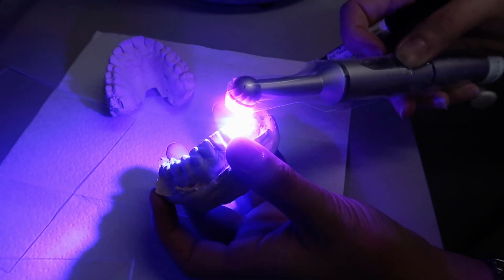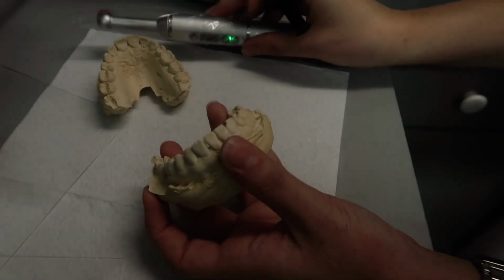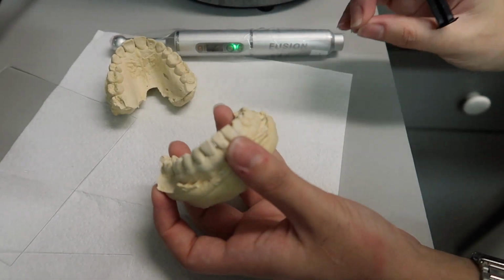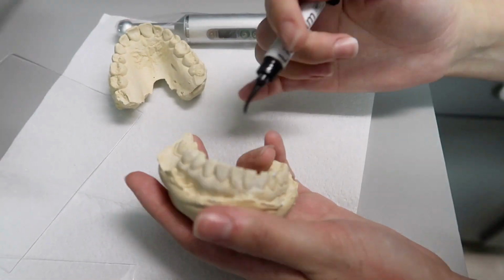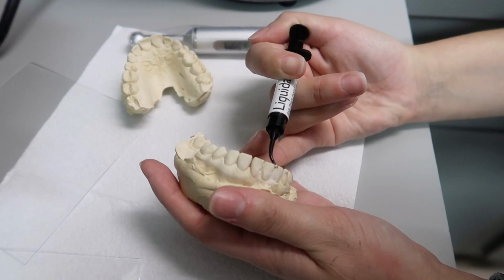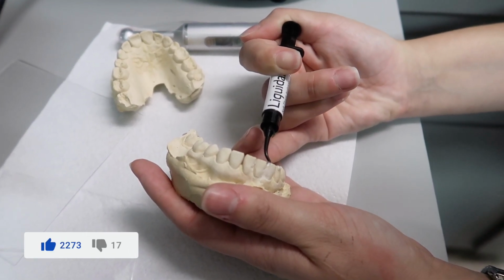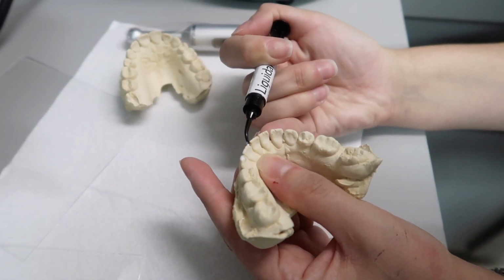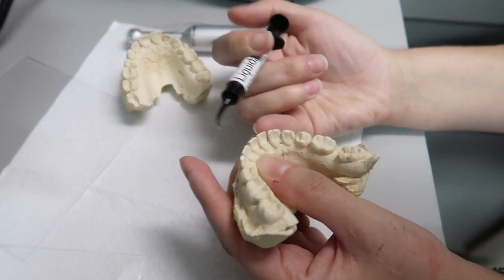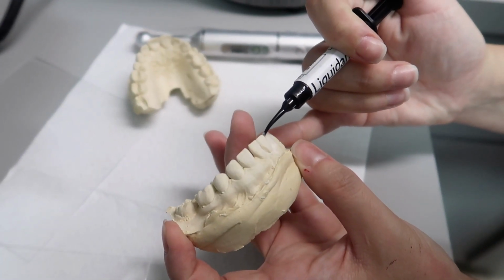And that's why it's very important for you to try the bleaching trays in your patient's mouth before they take it home. I know sometimes offices just like hand it to them, but you never know. Sometimes it doesn't fit properly and then the patient is stuck with these trays that don't fit properly and they don't know any better. So I really think it's always important to make sure the patients try it in and you make sure that they fit properly. I agree.